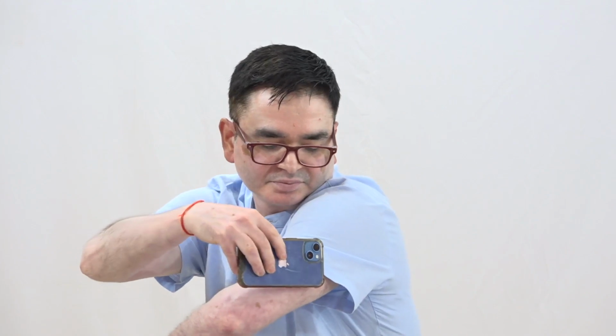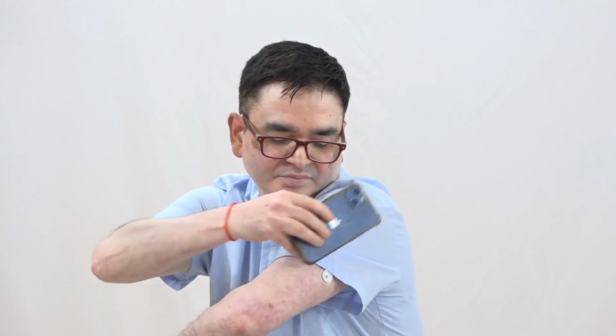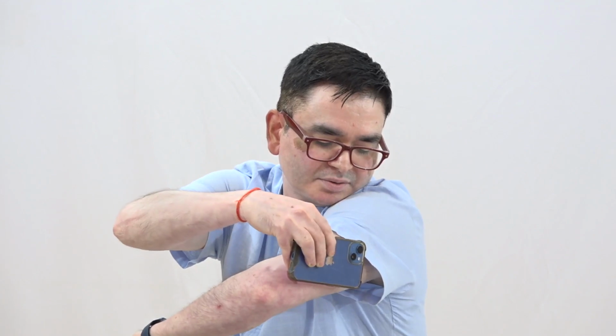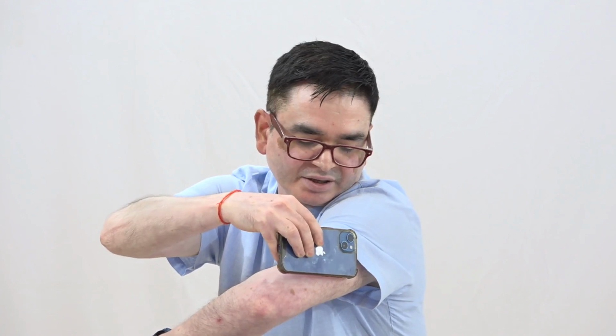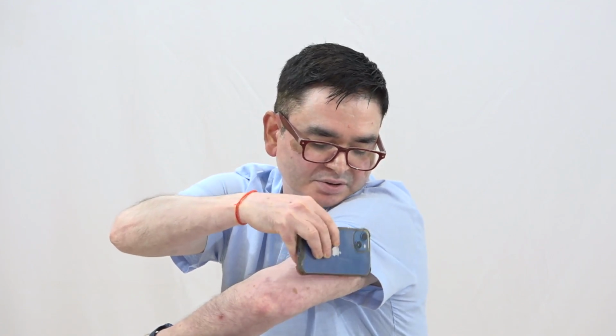I'll just make sure that my Bluetooth is working so that it can pick up the sensors. Yes, the Bluetooth is on. Scan new sensor. It should be fine. There might be some issues there, but that's more an issue with the Bluetooth.